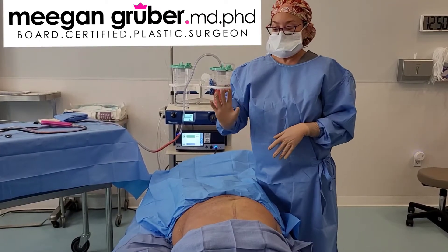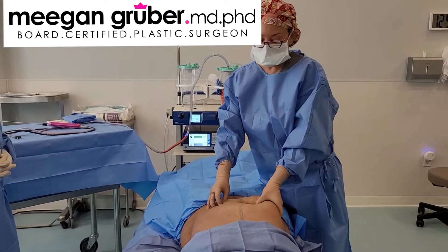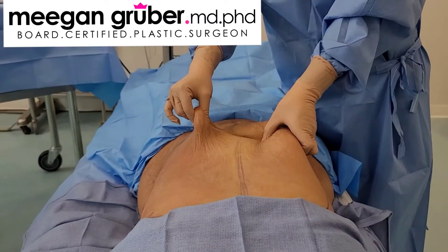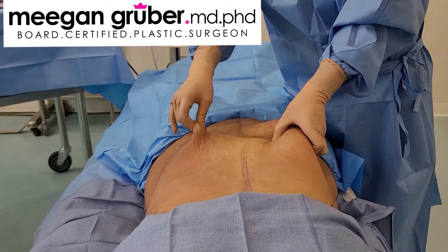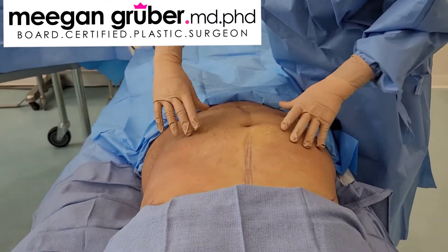So we just finished lipoing the left half over here and the right half hasn't been done yet. You can see the difference in thickness here. The left side has been liposuctioned thoroughly and here it has not, so we have quite a thin flap in all directions.